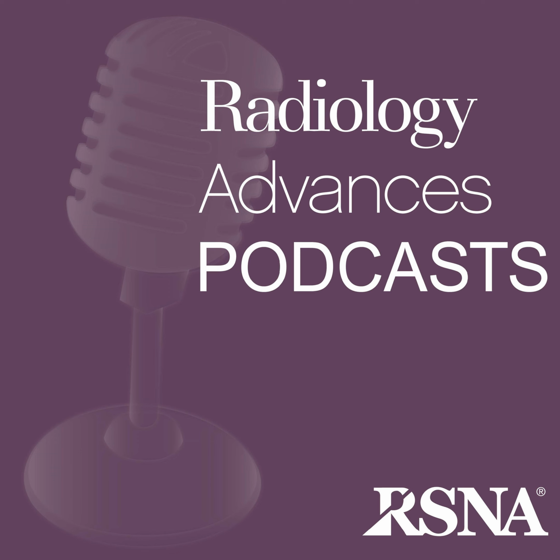But what does this all mean? What are the big implications? To start, for any center dealing with a high volume of screenings, especially for women with dense breasts, this could slash the false positive rate. Which means using resources better, fewer unnecessary appointments, fewer procedures, and less patient anxiety. It really makes the case for standardization. With subjective B-mode readings, individual radiologist performance varied widely. AUCs ranged from 0.54 to 0.76, but with GCNR applied to SLSC, that variability nearly disappeared. The range tightened to 0.93 to 0.98.